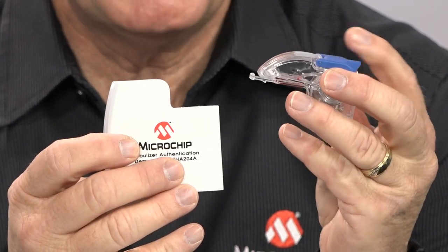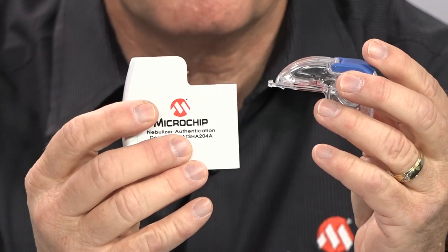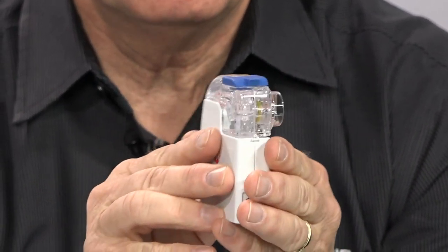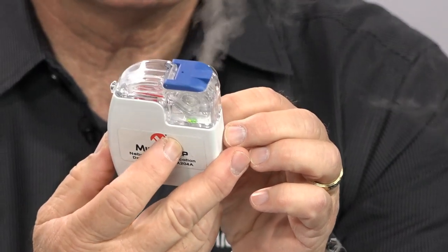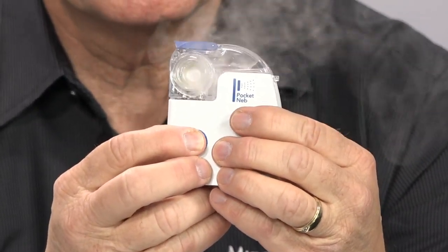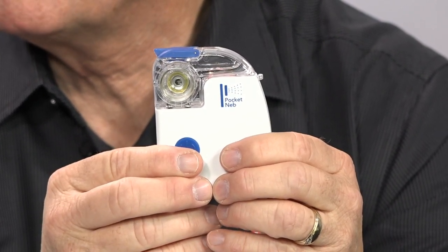Yeah, so if you put in a medicine cup that doesn't have the crypto chip and the proper firmware in here, it won't work. But once you plug it in, in this case you get the stream, and you can also see we get a little green light. That's hard to see there, but you can see it. Basically, it won't work without that. Right. So if you had a cup that does not have the right crypto authentication, it will not talk to it. Yep, it won't talk to it. It'll say, don't authenticate it.